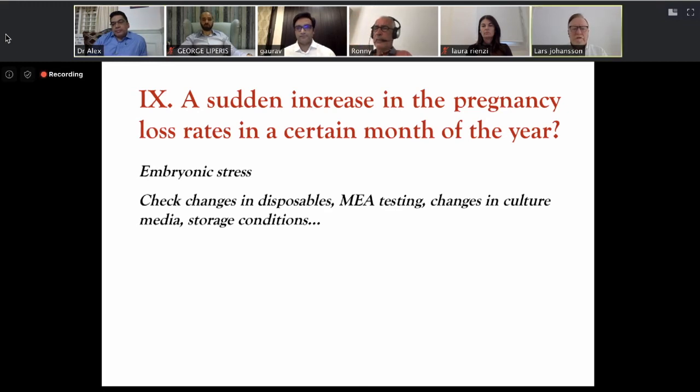Well, I can comment on that immediately since you mentioned LifeAir. The thing is that there are so many different detergents that are used out there, and the worst ever is 70% alcohol, and it's overused. It's reducing, but it does not eliminate everything. And then there are others out there, and I tested a lot of them, and I shouldn't mention any company names, but there are some that are cleaning up nicely, but they are sticky. And after that, it's really hard to work there.